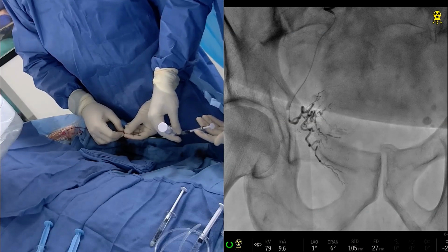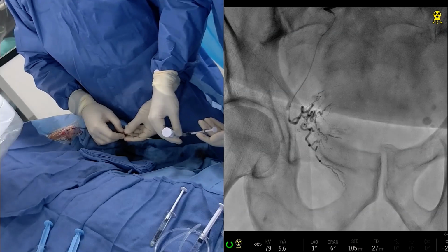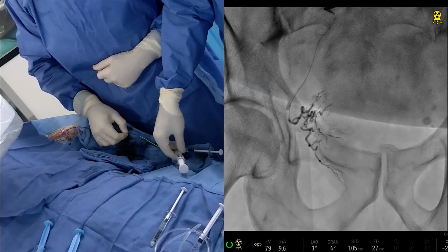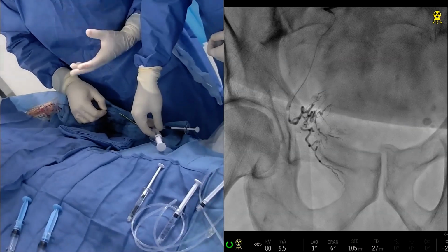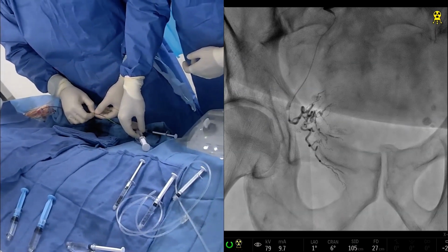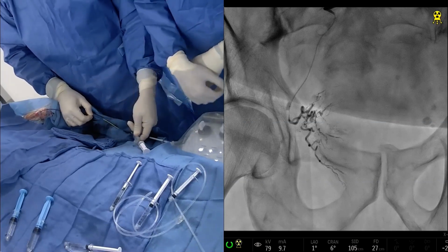So you see how it penetrated a little bit down into that rectal branch, which is not atypical. So basically what happened here is we filled the actual prostate tissue, and as we were filling the prostate tissue, that tissue became high pressure, and so it redirected some of the flow away from the prostate itself. And so when we see that, it's almost like we coiled that vessel. It's not going to have any real issue for the patient.